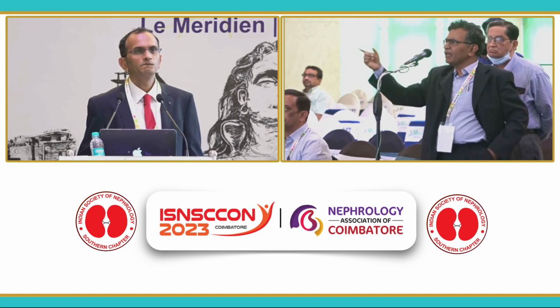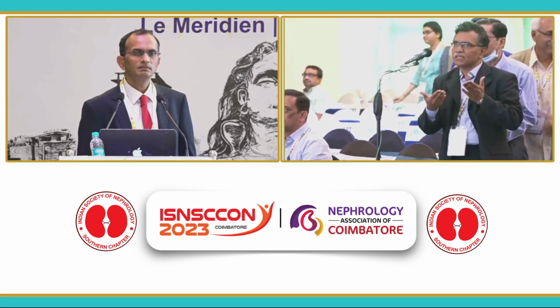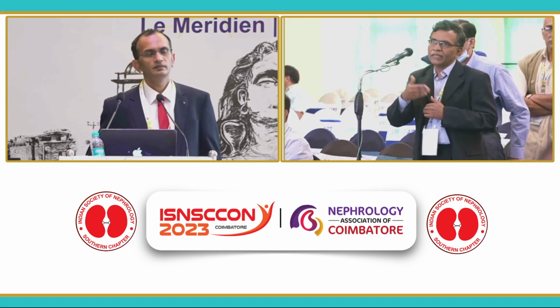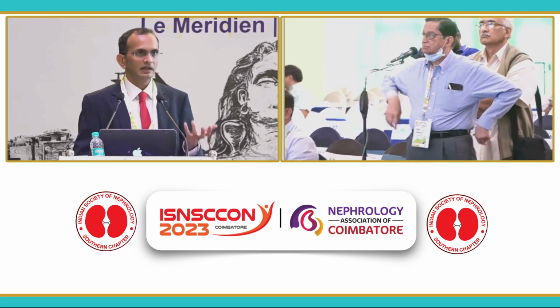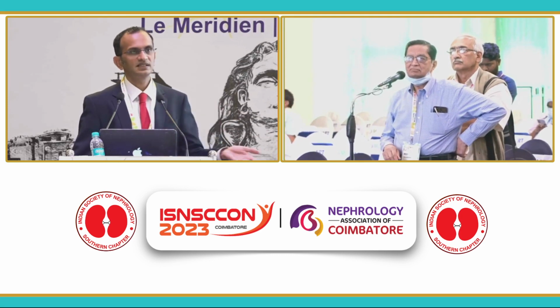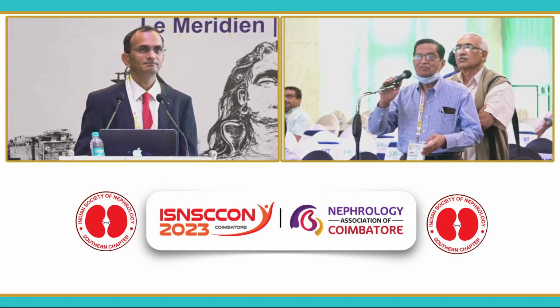Secondly, covering the entire surface may not be necessary because it's like a CT scan, as long as you're covering the cross section, that may be sufficient. Again, I don't know. A post-mortem of the dialyzer may help you see whether the energy is focused along the entire surface. Yes, sir. There was no difference in the potassium values. As you said, it's a smaller cohort, which is why we tried to analyze not only LDH but all the parameters of hemolysis, like the bilirubins, and we didn't find anything, because that is something we were really worried about as well.